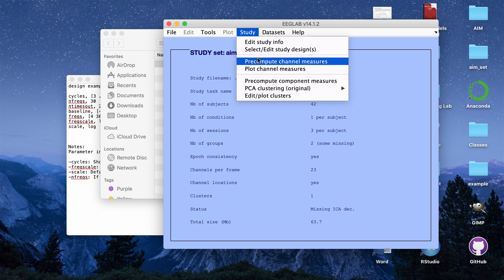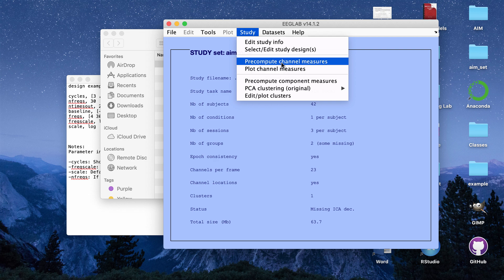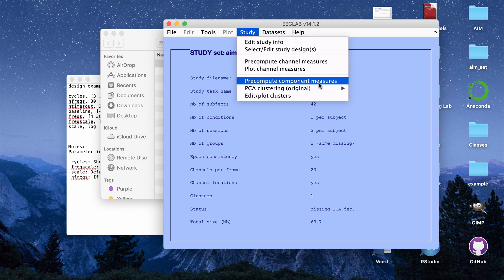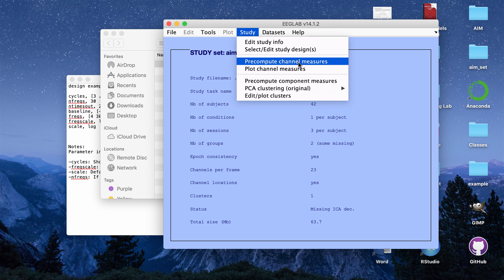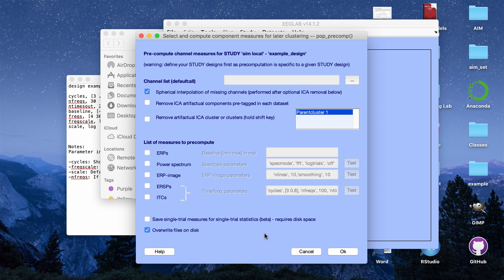Next, I'm going to go to either 'Pre-compute Channel Measures' or 'Pre-compute Component Measures'. You can create time frequency plots per channel using channel measures, or based on independent components. I'm going to create time frequency plots based on channels, so I'll click 'Pre-compute Channel Measures'. That opens a window asking how I want to create the plots. There's a checkbox, automatically checked, that will interpolate missing channels based on surrounding neighbor channels.